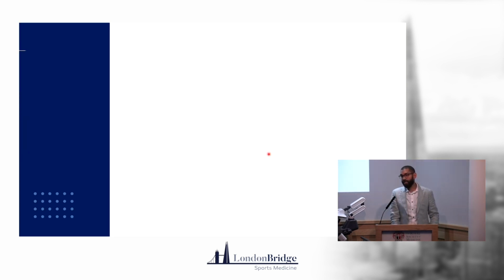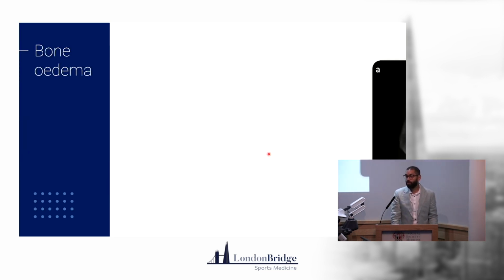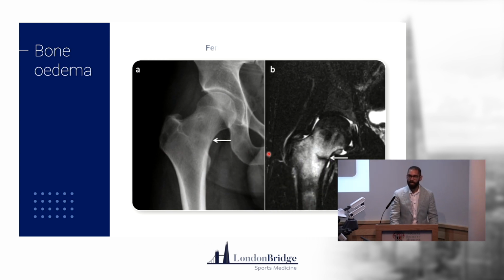Often when in the MRI scanner, you can kill two birds with one stone as well. So you can ask for an MRI of the pubic and the groin and even the femoral shaft if you want to. So don't be afraid to get all your requests in. The only time that becomes an issue is, again, if they're self-funding a patient and they count that as 3 separate body parts, so the patient gets charged a few times. And I think sometimes that's difficult in NHS land where you're allowed certain types of body parts. So just check that your provider's happy to do it.